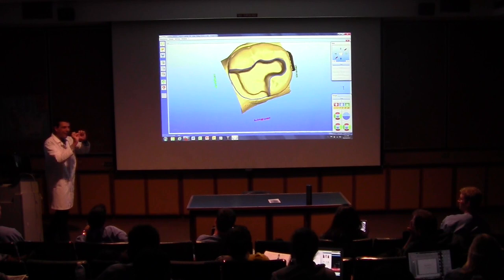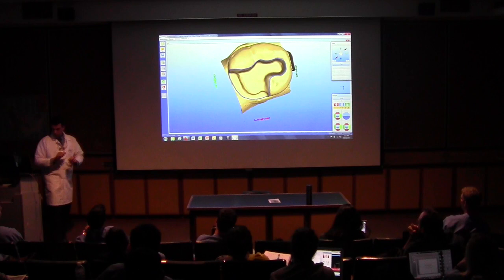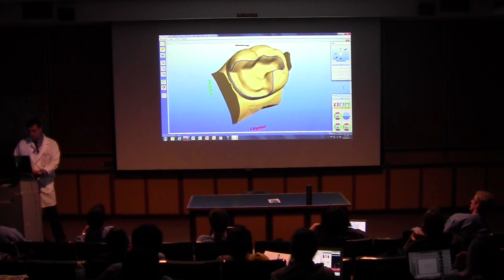You have a line angle there, everything is nice and smooth. However, the external cavosurface margin is closer to 90 degrees. It's almost like a sharp angle, right here. Is that clear? I don't like that margin either. Let me fix that.